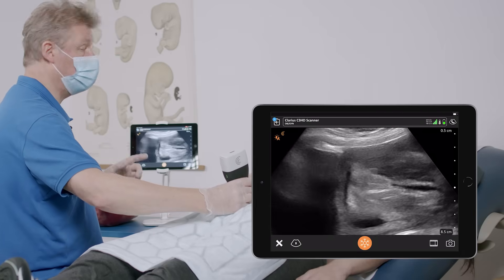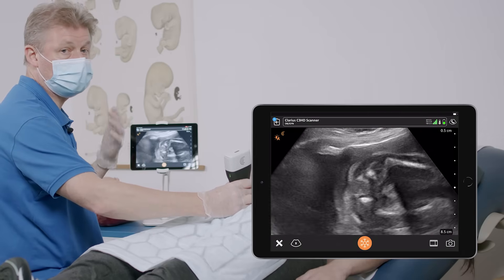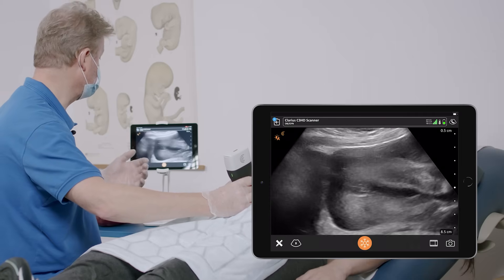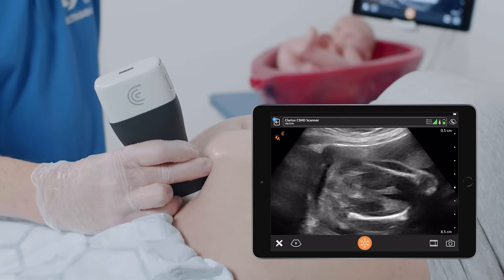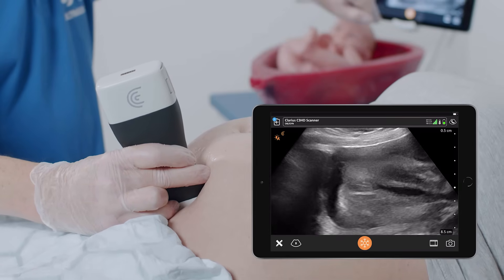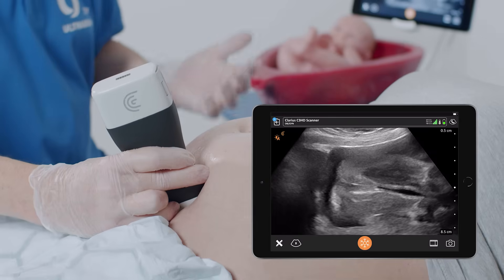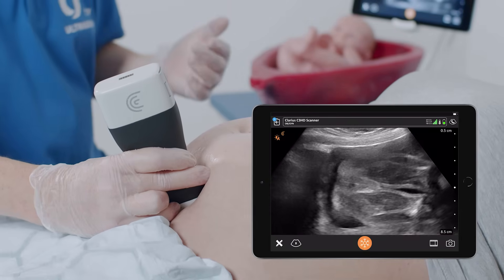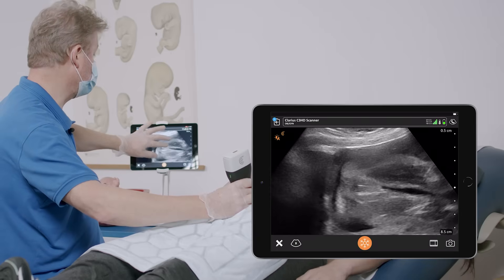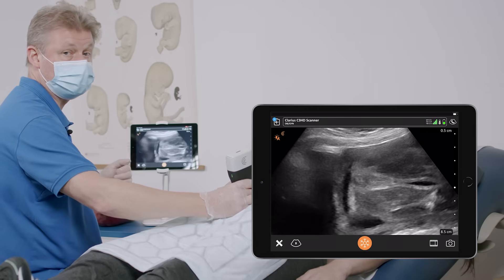If you are not sure, it's better not to tell the sex of the baby and to repeat the scan during the same examination, because with the close position of the two legs you can make a mistake and not recognize a male baby. So be very careful. For me, I'm sure this is a female baby, but if you are not sure, try again and ask the baby to open the legs in order to reveal the gender better.